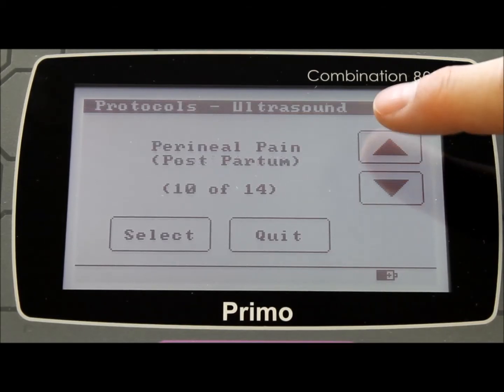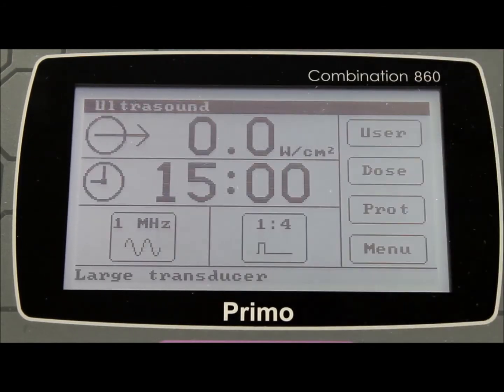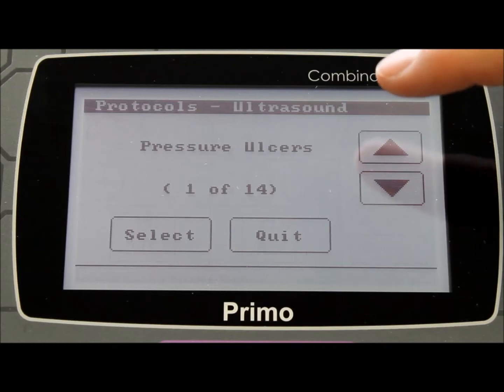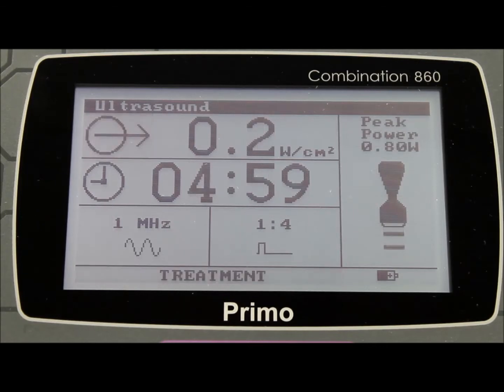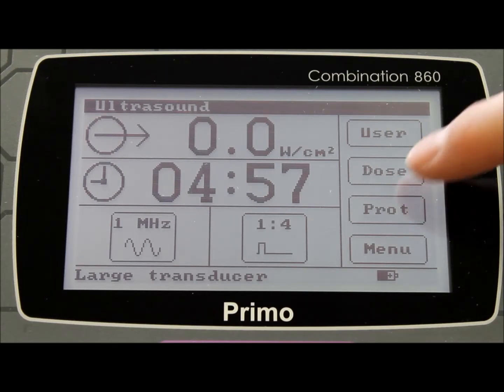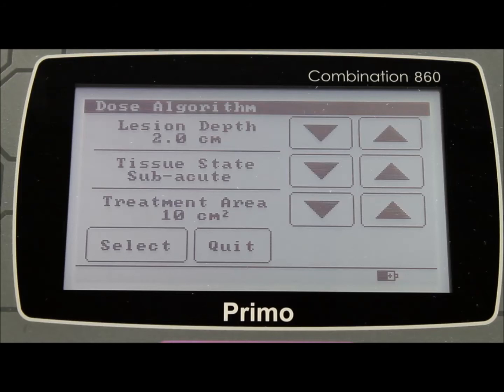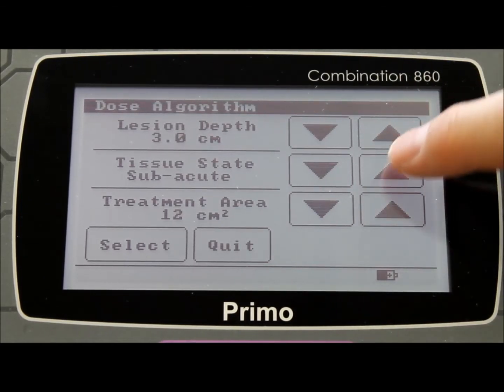Each patient condition is listed and once chosen, the machine is set automatically to the correct setting for the optimal treatment of the condition. The user simply has to apply the treatment head to the patient and increase the output to the maximum allowed. Likewise with the dose algorithm, the settings have been exclusively provided to EMS Physio by Professor Tim Watson and allow the therapist to set the machine to the correct output depending on parameters including the depth of the lesion, the size of the lesion, and its chronic or acute state.